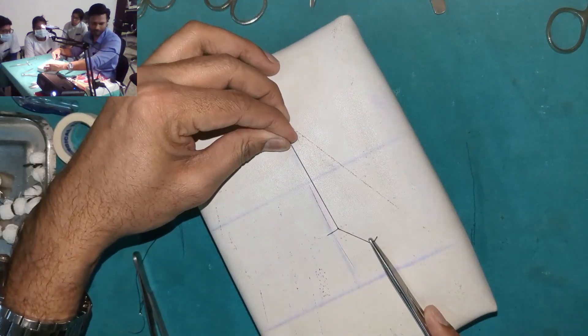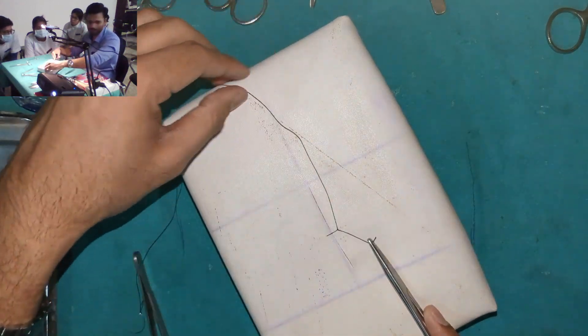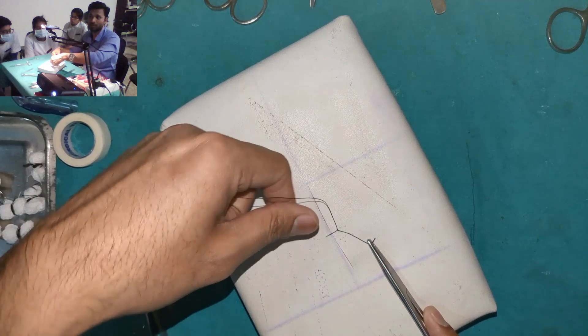Ideally, you use this as a guide, and you just pull this, and the knot forms here. This was one throw in clockwise direction, right?